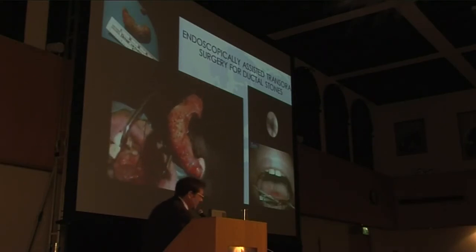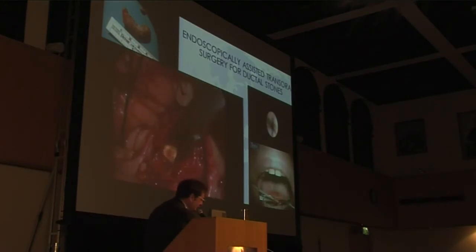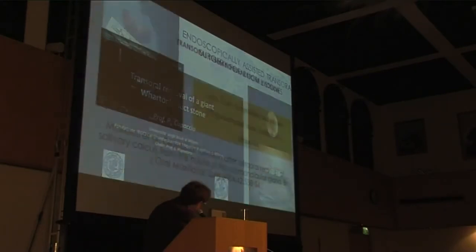This is an important thing. You know that the mylohyoid muscle, like the masseter muscle, makes an angle to the ductal wall that possibly may favor the formation of a stone. It is better to perform after marsupialization of the duct an endoscopic check for any residual fragments in the main duct and also in the hiloparenchymal region. This is part of the new way of thinking about minimally invasive procedures for submandibular stones.